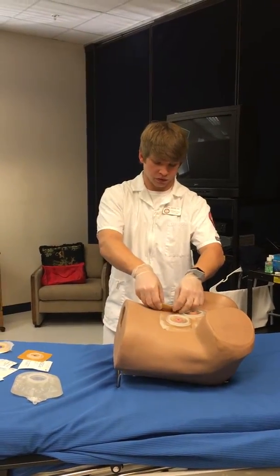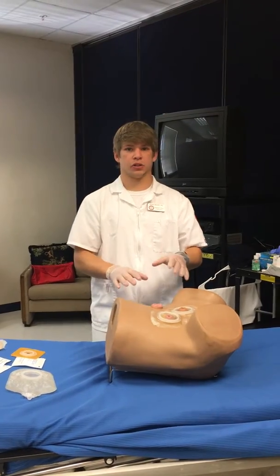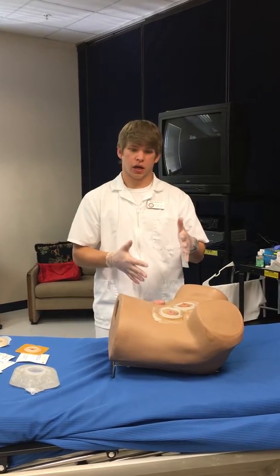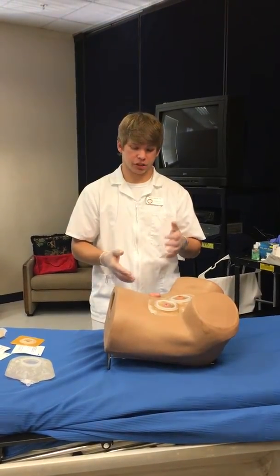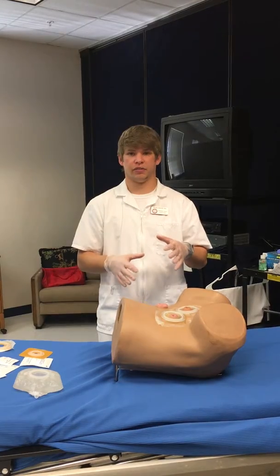Next, come up and remove the old pad, discard it, and check the stoma. Look at it and make sure it's pink — you don't want it to be swollen or inflamed, you don't want it to be red, and you don't want it to be yellow or black, as that would indicate infection or decreased blood flow. Check the coloration and ask the patient how it's feeling.